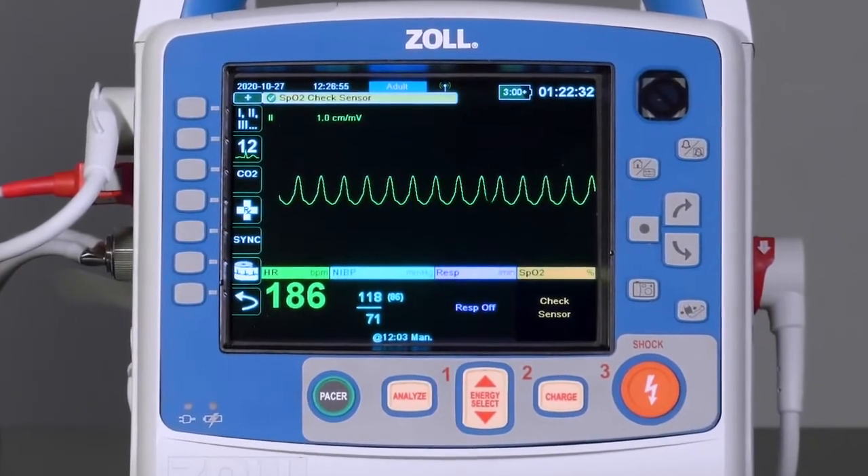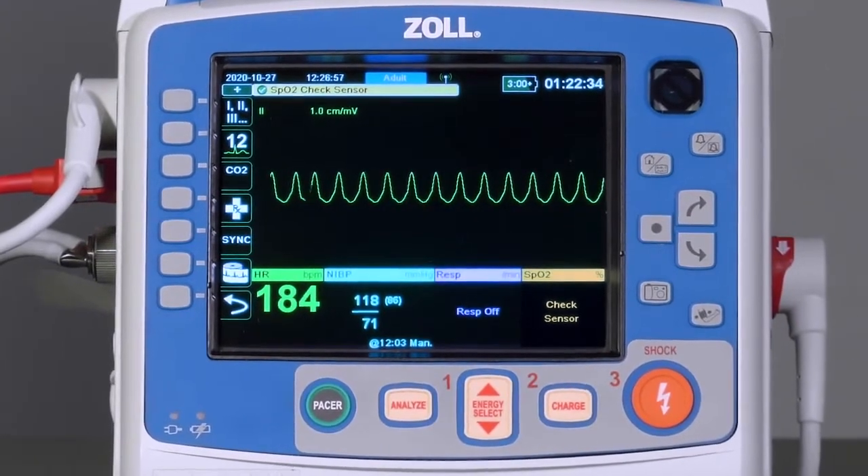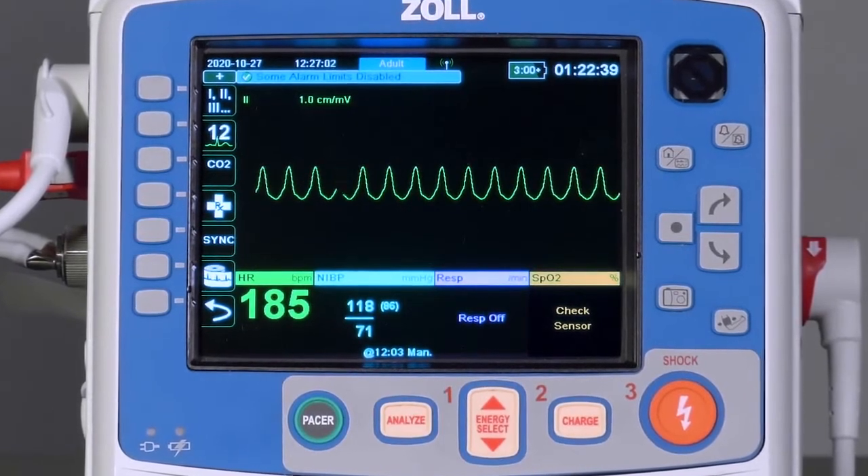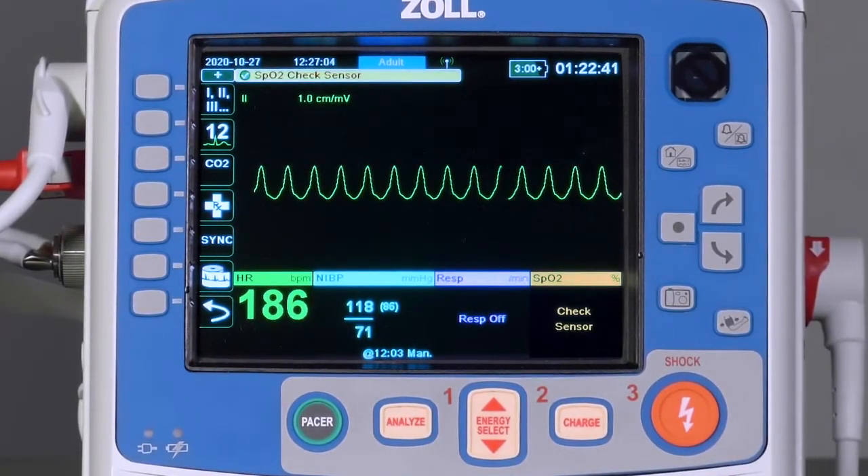This reduces the chance of inducing ventricular fibrillation. Performing a synchronized cardioversion on the X-Series Advanced requires the use of the Sync button, found on the left side of the main screen.